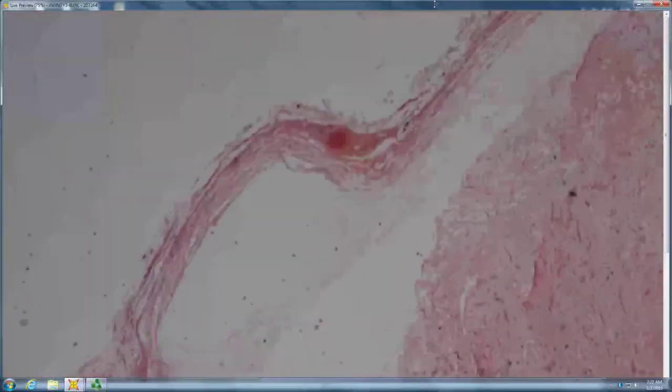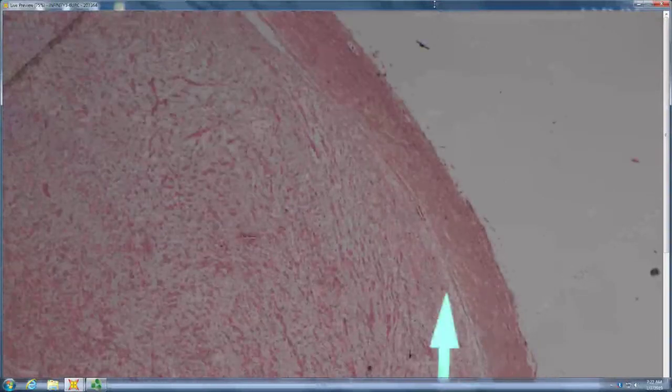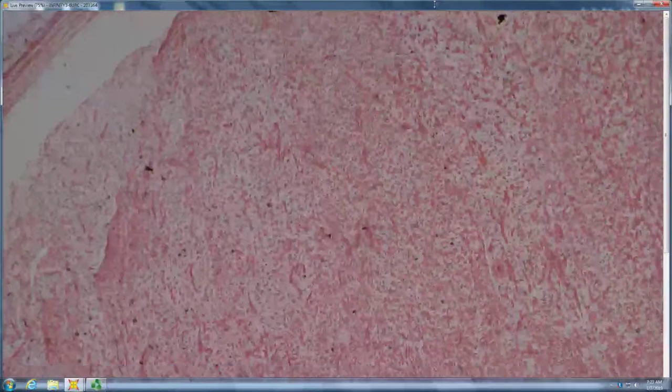So, let's do something a little bit fun. Okay, so it looks very myxoid. It's very large. Myxoid. Do you see attached skin? No. Or is it just a large, roundish mass? Very large, roundish mass. Encapsulated or not encapsulated? Encapsulated. Yep. And is this one of the schwannomas without the Antoni A?